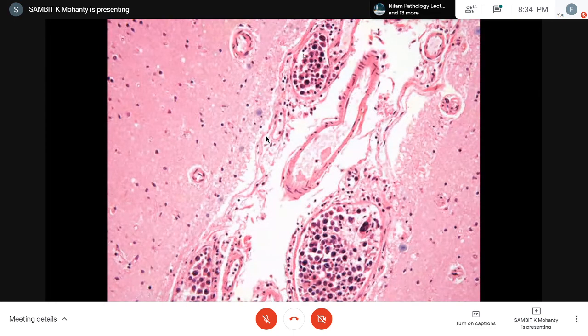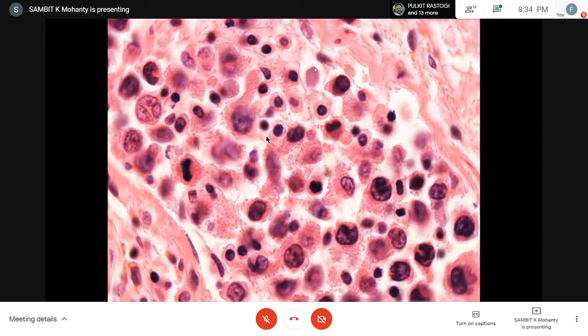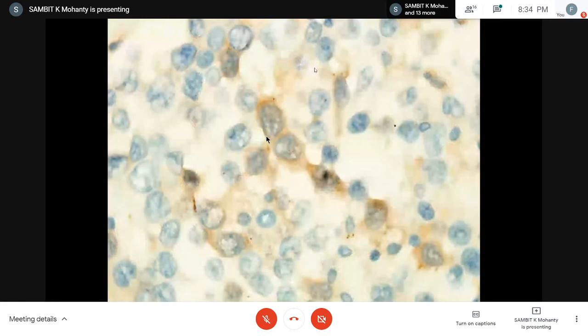Yeah, a lot of them. Irregular nuclear membrane, convolution, heterogeneity in their size. There's some small, some big.